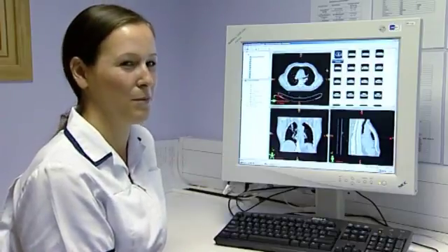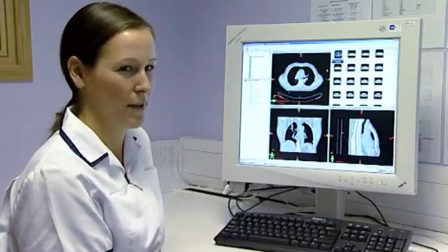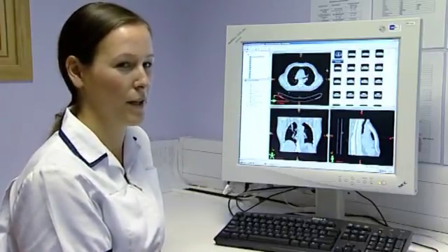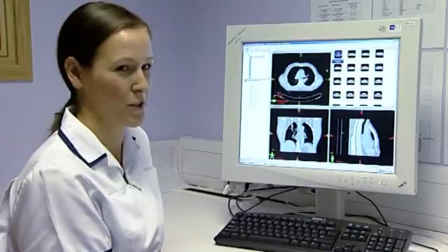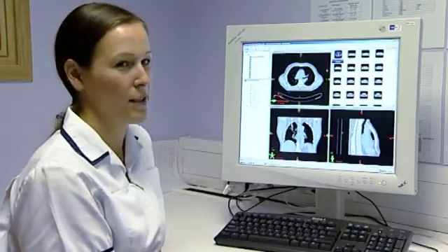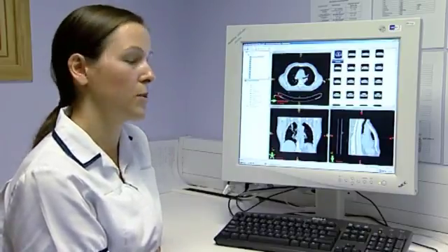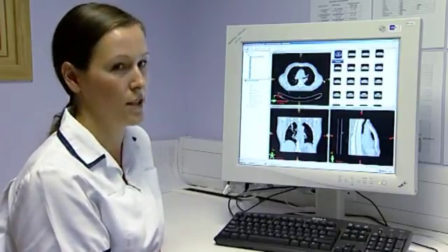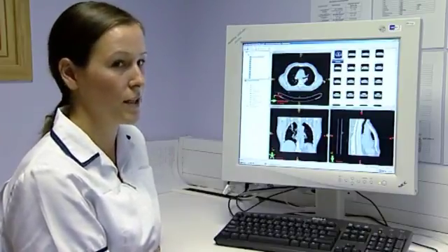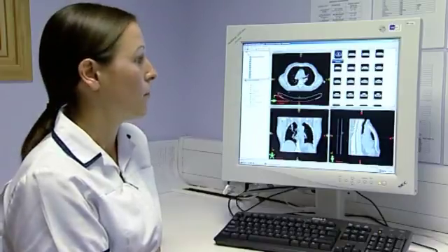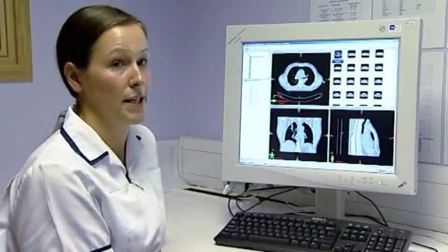My name's Kim Bicken, I'm a Senior 1 planning radiographer and I work here at the Royal Berkshire Hospital. Today we're going to look at the planning of a non-small cell lung carcinoma patient, planning in 3D.